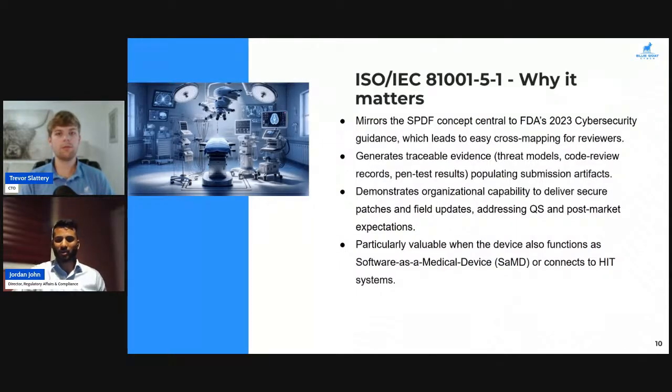And in terms of regulatory affairs alignment, the documentation you create is important in this aspect. It aligns really well with your FDA cybersecurity guidance in topics like coordinated vulnerability disclosure, your incident response planning, post-market management of any kind of threats, and using even things like metrics in your patch deployment, for instance.